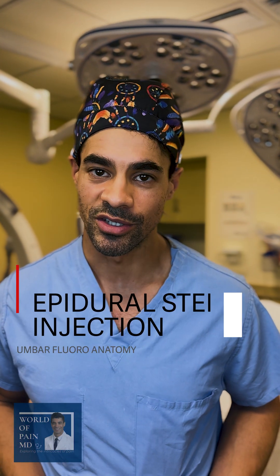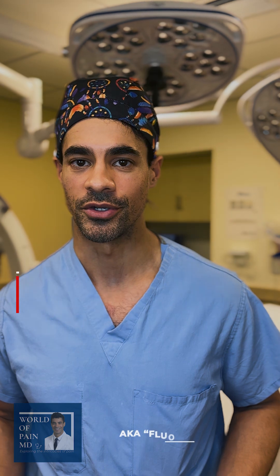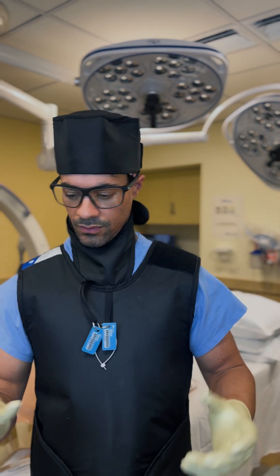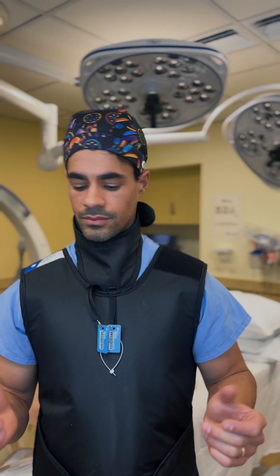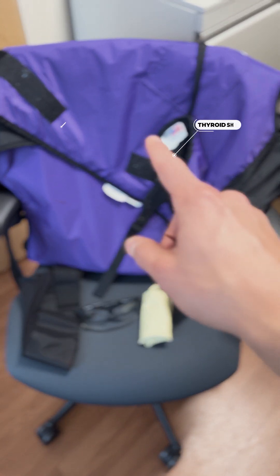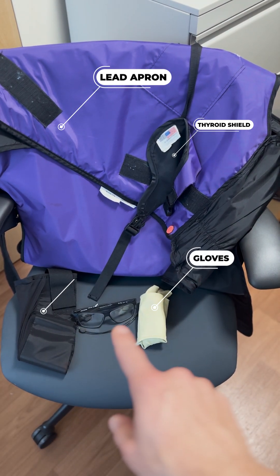In this video we're going to talk about a lumbar epidural steroid injection and lumbar fluoroscopic anatomy. Anytime you use a fluoroscope there's use of radiation, so you have to talk about radiation safety. Common radiation safety equipment includes a thyroid shield, lead apron, radiation attenuating gloves, hat, and glasses.